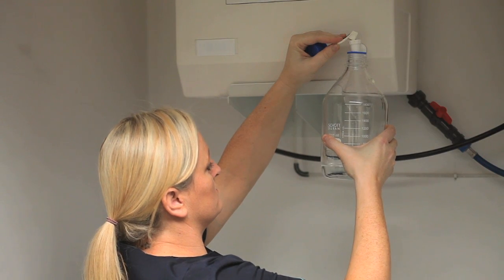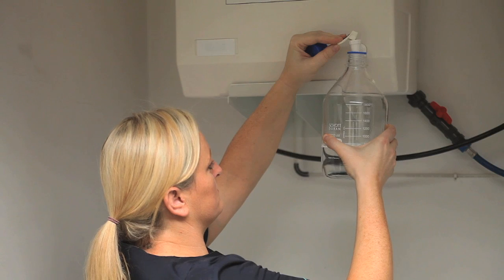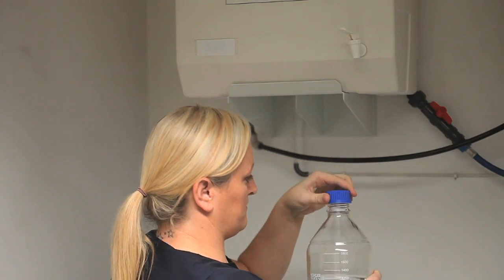Dissolved chemicals and particles present in the original water supply do not pass through the RO membrane. RO technology is commonly used to generate drinking water from seawater. Reverse osmosis water is recommended for the disinfection fill stage of the washer disinfector, as this water has very low levels of dissolved or suspended chemicals and minerals.